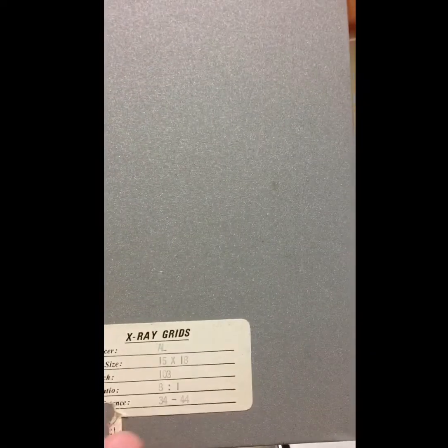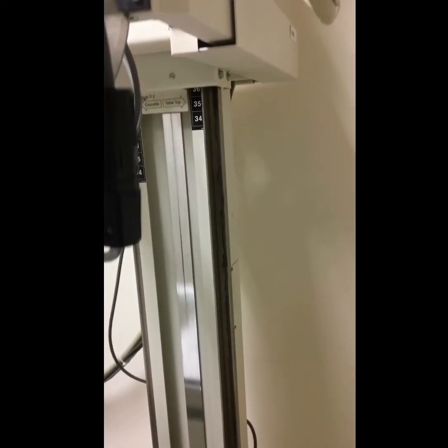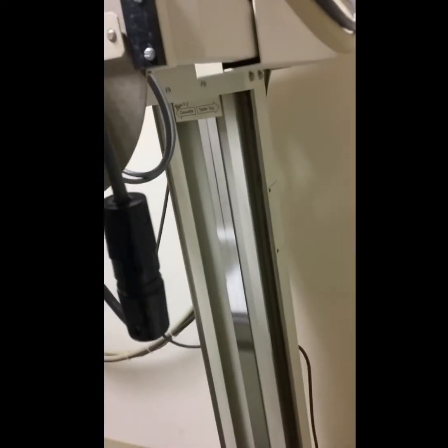Okay, so here we have the grid, and each grid has a specific distance, 34 through 44 inches. Now, once we place the grid here, we're gonna have to lower the SID to less than 34, and we're out of the range.